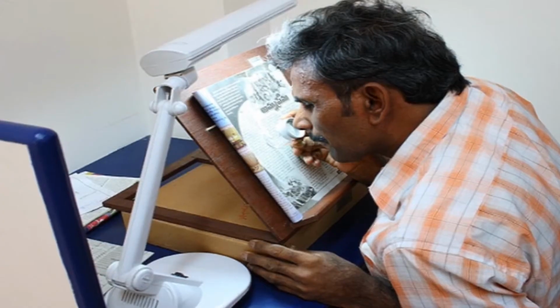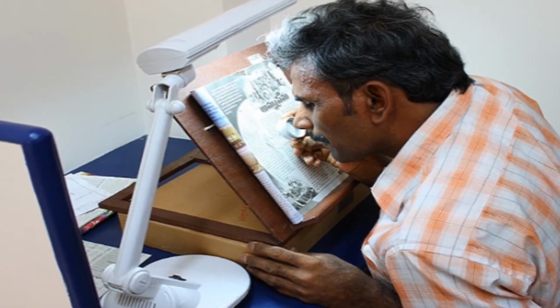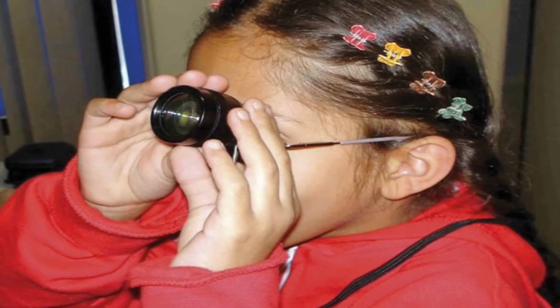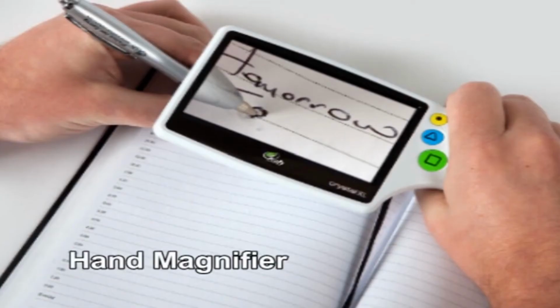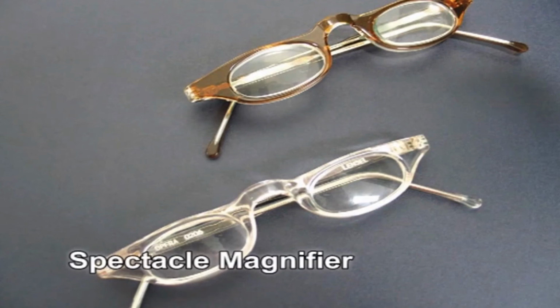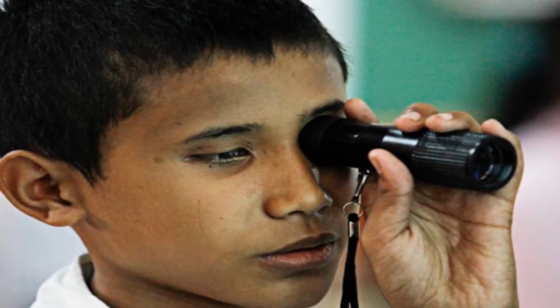Near vision devices are designed for magnifying the objects and print close to the person. Distance devices are for magnifying things in the distance, that is about 3 meters to far away. Near vision optical devices consist of hand magnifier, stand magnifier, and spectacle magnifier. Telescope helps to improve distant vision for persons with low vision.